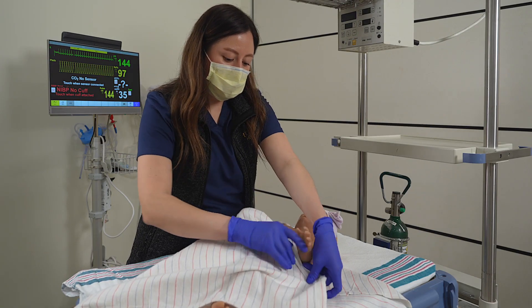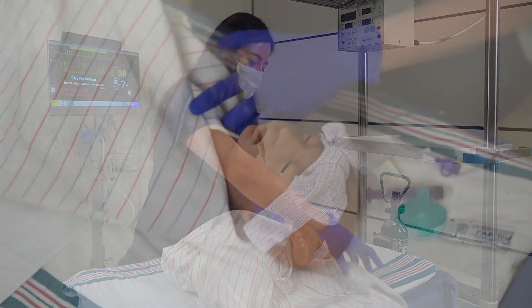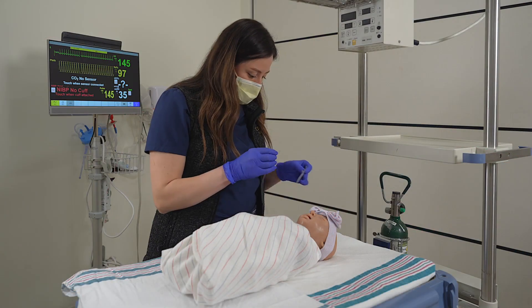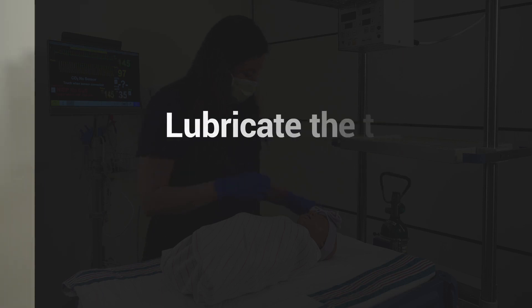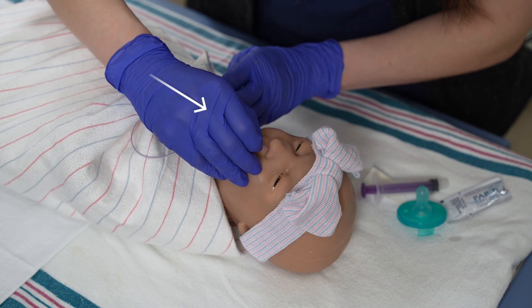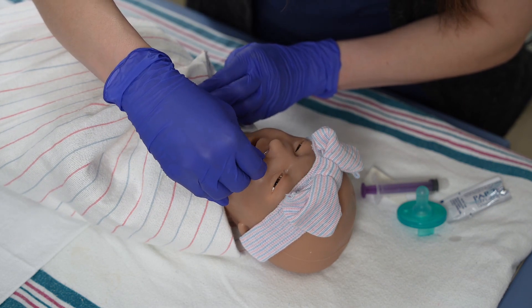Swaddle the infant and flex the neck slightly. Lubricate the tube with lubricating jelly. Insert the tube straight back into the nare. Advance as tolerated to the measured length.